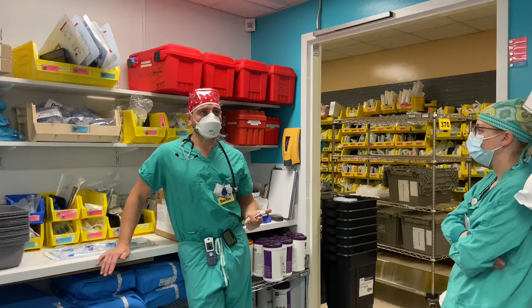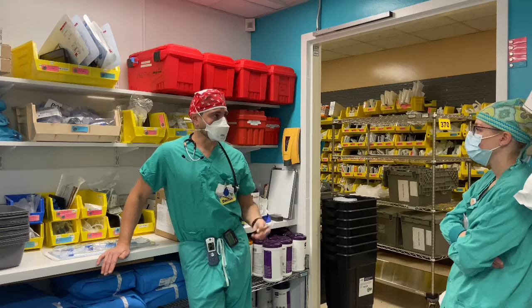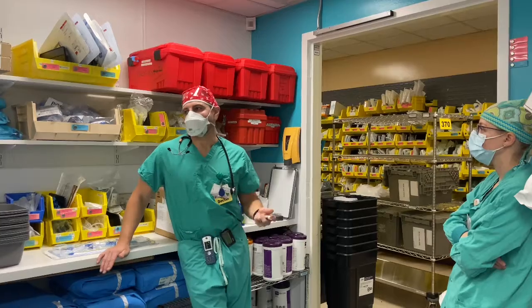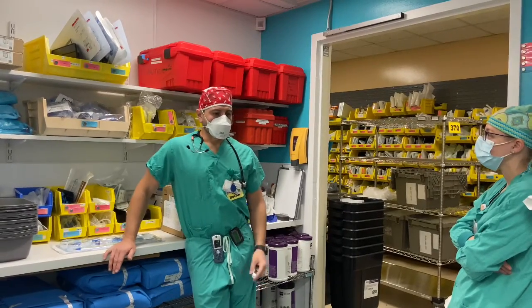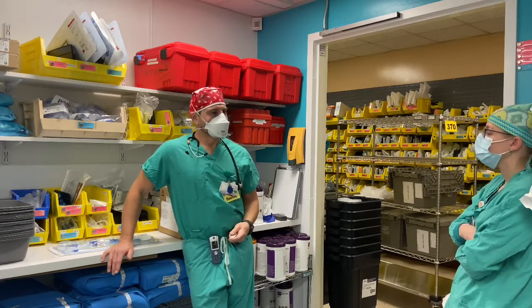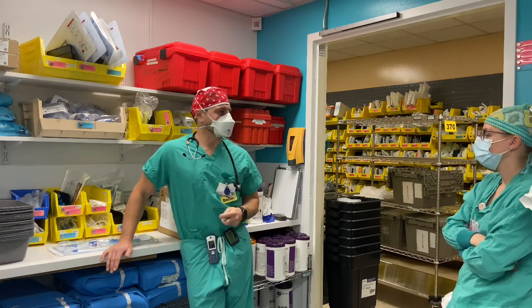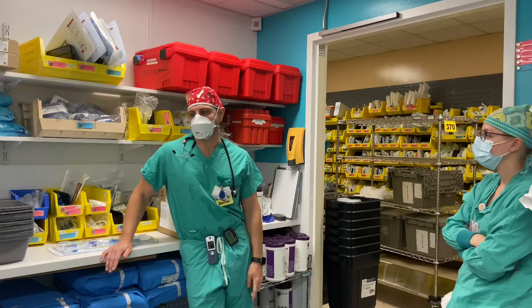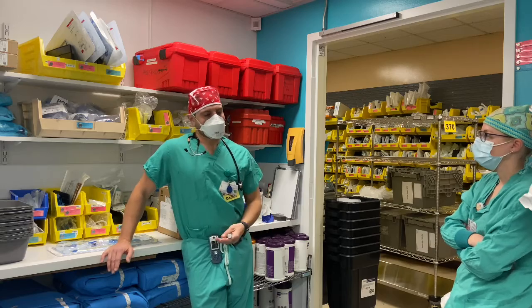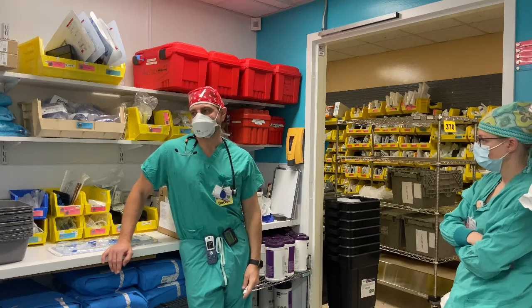Each different type, either nasal cannula or simple mask or non-rebreather, will deliver a different FiO2, which is the fraction of inspired oxygen. That's what FiO2 stands for. Normal room air is about 21% oxygen, and when you put a nasal cannula on, every liter you add gives roughly 5% more oxygen to what the patient is breathing in. But you also need to make sure you're delivering enough oxygen, depending on the type of mask you're using, to prevent the patient from rebreathing their own exhaled gases like carbon dioxide.